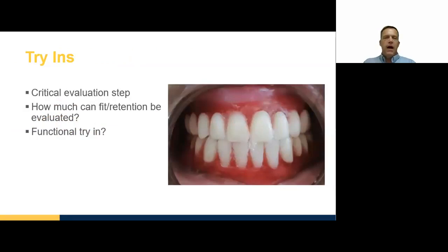So we'll send it to the lab, they'll make a base plate and do a setup. Sometimes when we do our setups, we think, it's just a setup, who cares? But we really want to focus on this point from two directions. One is that this is the first time the person is really going to see what our proposed treatment looks like. So we want to make sure it looks good, that they say, oh, wow, this is cool, feels good. We want to talk to them about the fit of it.